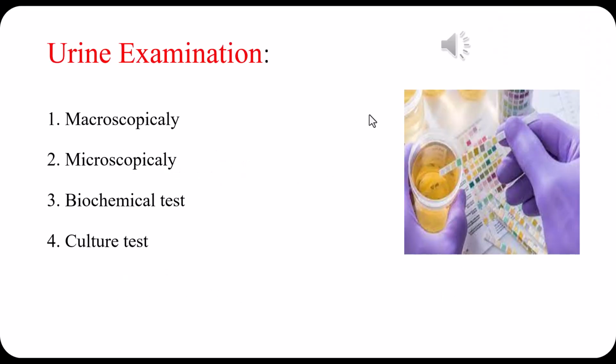Hello everyone. Today our lecture will be about urinalysis. What is a urine test? In a urine test, we do many examinations on the urine sample. We have to do microscopic examination, biochemical tests, and then a culture test.